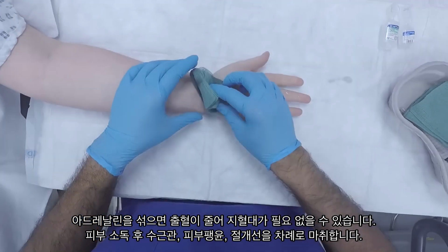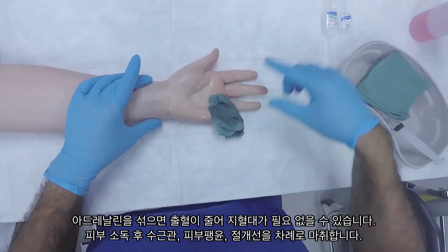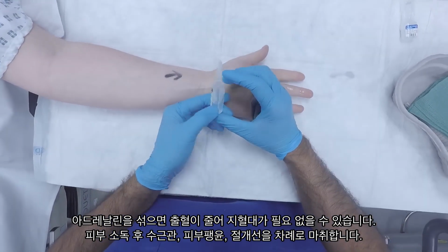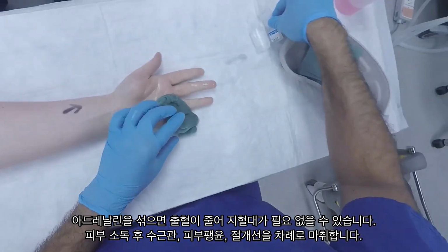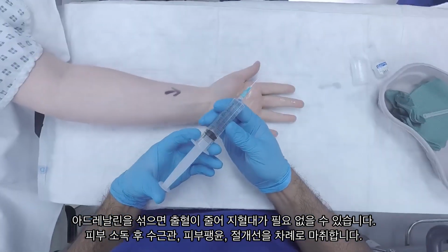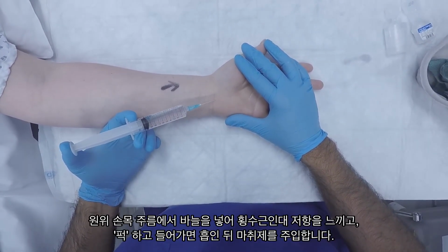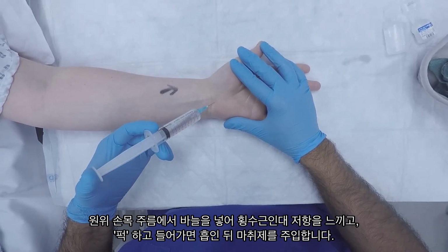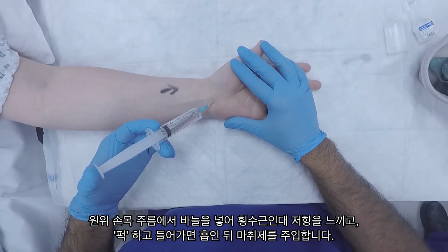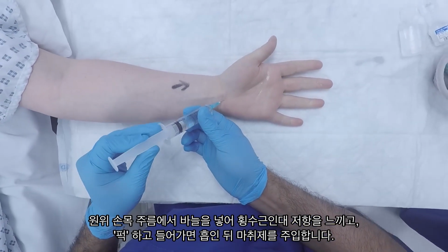You're going to first infiltrate the carpal tunnel itself, then come back and raise a skin bleb, then infiltrate along the incision inside. Start with your needle in line with your incision at the distal wrist crease. Aiming about 45 degrees dorsal and distal, insert the needle until you feel the resistance of the transverse carpal ligament. If you push a little harder, you'll feel a pop as you overcome the resistance and enter the carpal tunnel. Aspirate, then inject the first few mils.